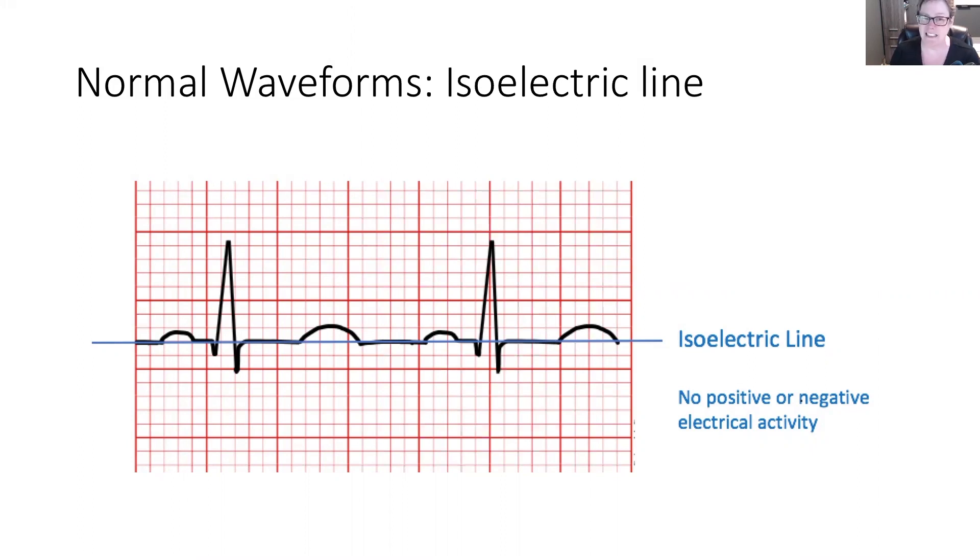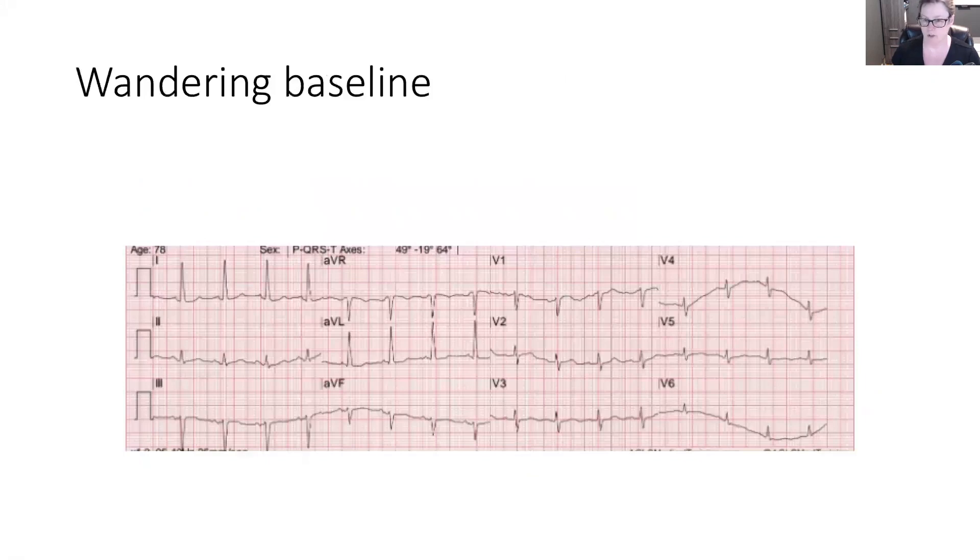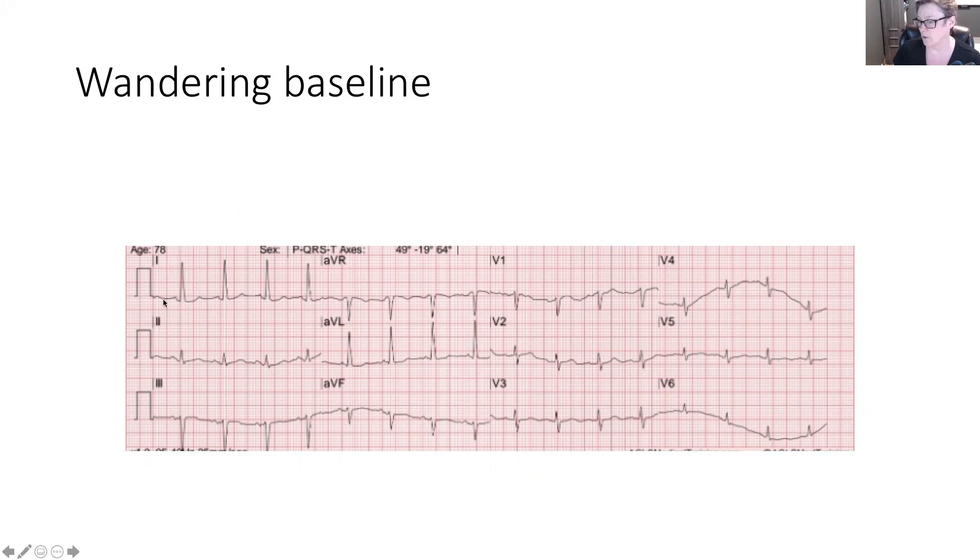Not all ECGs have an easily identifiable isoelectric line. It would be great if they did. So we're going to look at two examples. The first one here is a wandering baseline. You'll notice here, this is not lead two. There's lead one, lead two, lead three. But even in lead two, I can't just draw a straight line all the way across because it kind of dips down. And so this would be a difficult one to find the isoelectric line, but not a difficult one to analyze because we can still see very distinctive waveforms that we can measure.